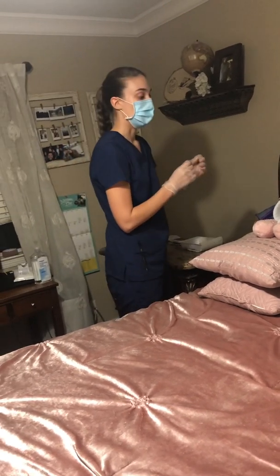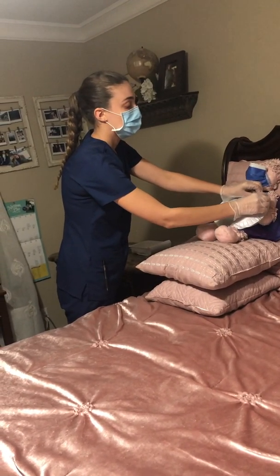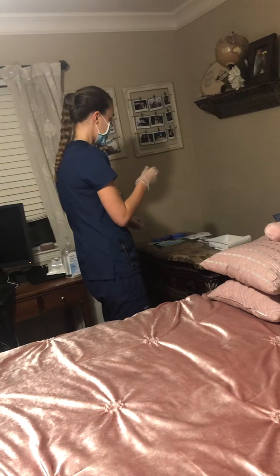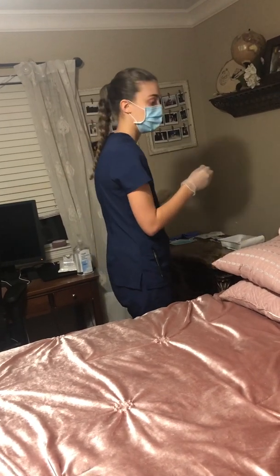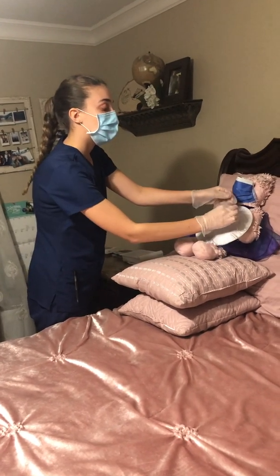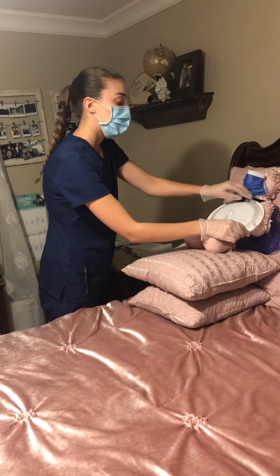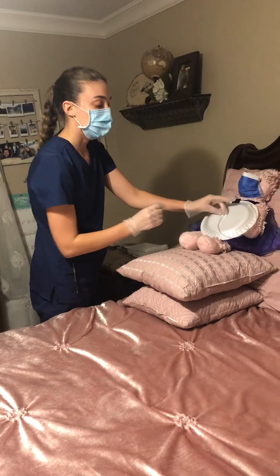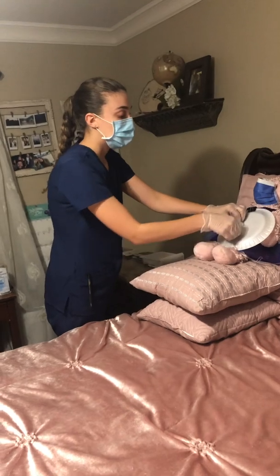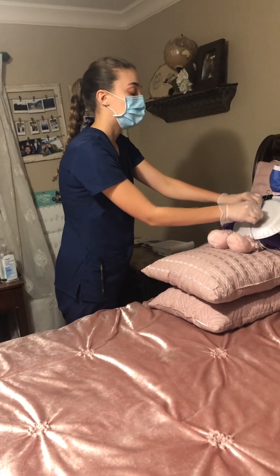Okay. Alright, I'm going to go ahead and start by taking off the tape. Okay. I'm going to assess the tubing, make sure that the cap is on tightly so no air comes in, make sure the lock is locked so no fluid comes out. Okay, I want to take my measuring tape and measure from the insertion site to the lock to make sure that it stays within those 4 inches the whole time. I'm going to stabilize the tube and start from the outer to the inner, pulling the dressing off.